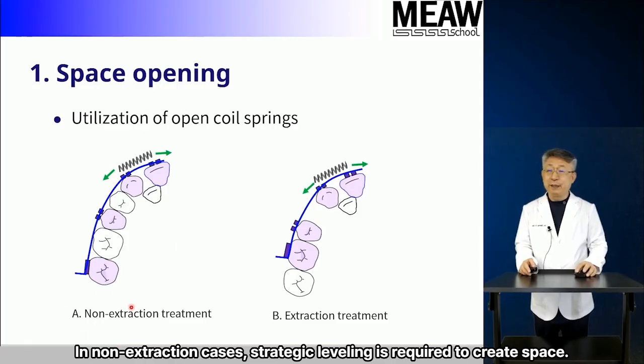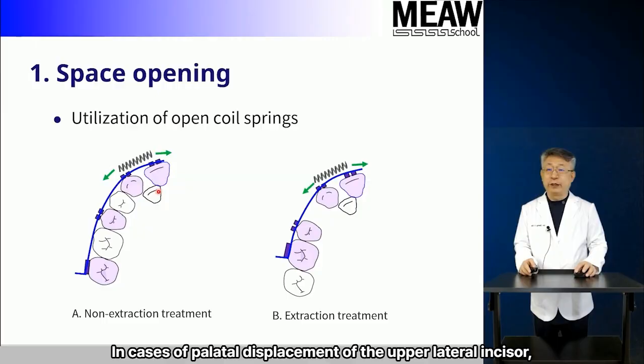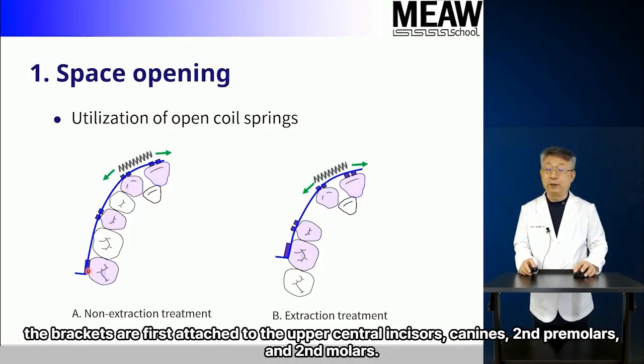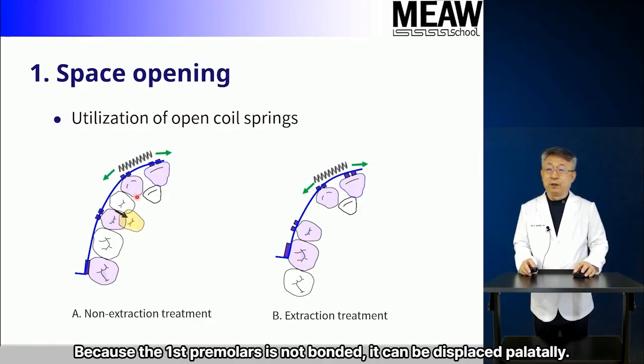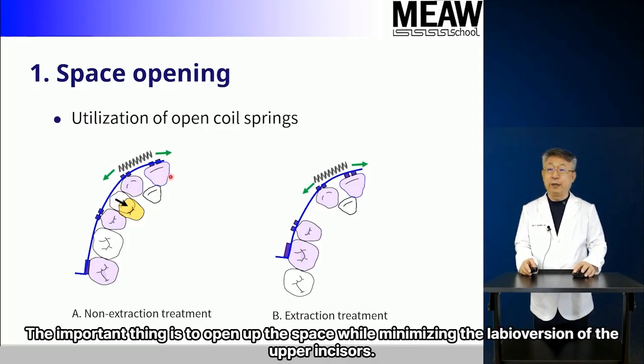In non-extraction cases, strategic leveling is required to create space. In cases of palatal displacement of the upper lateral incisor, the brackets are first attached to the upper central incisors, canines, second premolars, and second molars. Then, by using open coil spring in the lateral incisor area, the central incisors move anteriorly and the canines move posteriorly. Because the first premolar is not bonded, it can be displaced palatally. The important thing is to open up the space while minimizing the labioversion of the upper incisors.